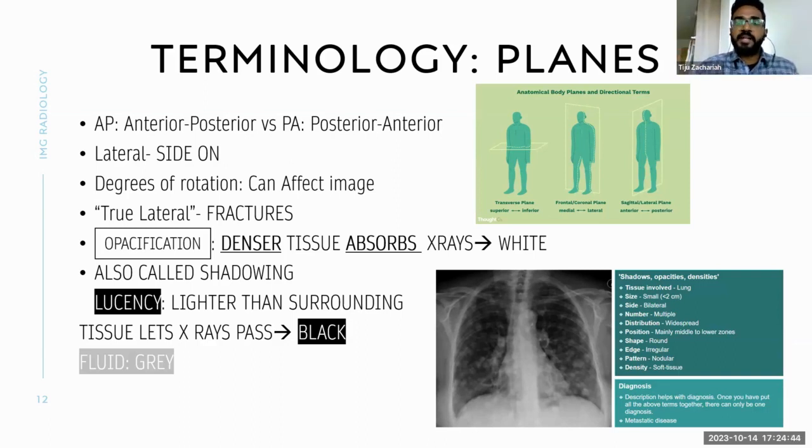That is one thing. Second thing is, because the person is standing upright for a PA view, he'll be able to breathe in more, which means more expansion. We can see more area in the X-ray. AP view is usually taken within ICUs, where the patient is usually not able to stand up because of many reasons. And they will usually be lying either flat or in a 45-degree plane. So the view is much less, one, because they can't breathe properly because the abdomen is preventing the expansion, and also because of the weird angle in which the radiation falls on the body part.